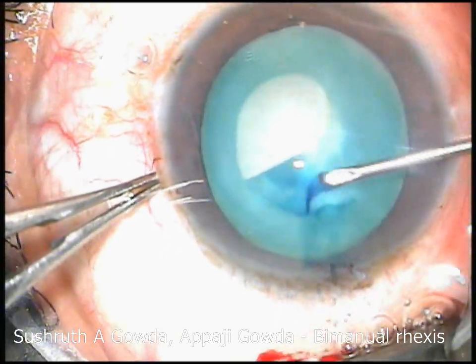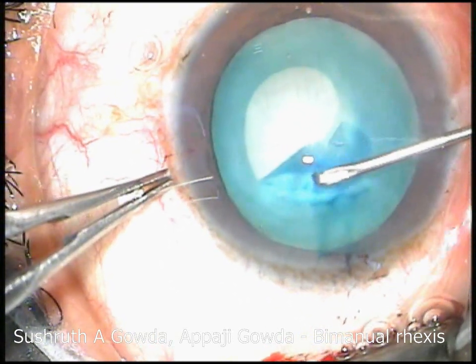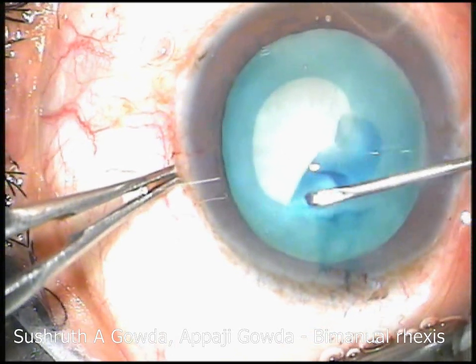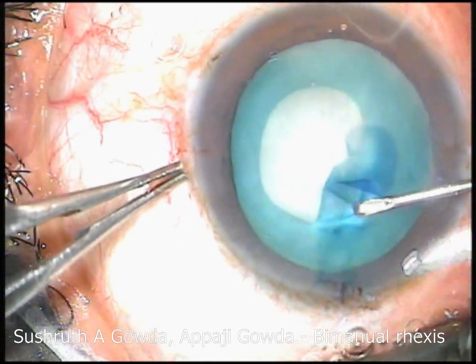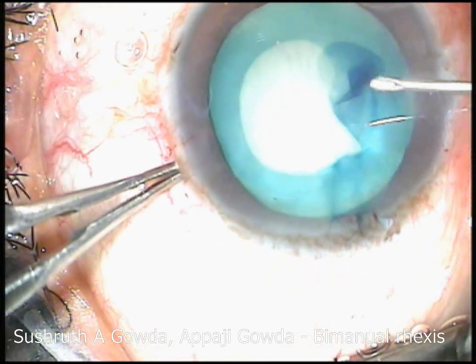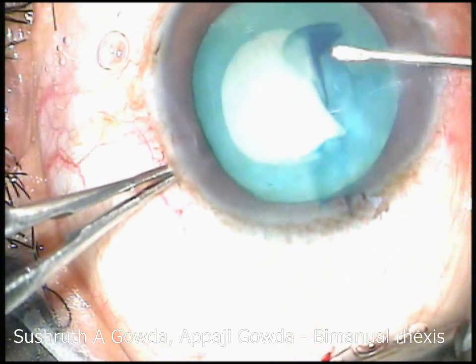Here you can see I have reflected a flap and I am trying to engage the shearing as close to the center as possible. I re-adjust the flap to get the desired shearing, and no matter what I do, there is a tendency for the shearing to proceed towards the periphery. This is sort of a dangerous situation.